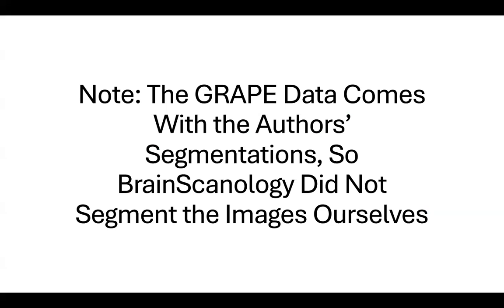An important point is that for this dataset, we did not segment the cup and disc outlines because the dataset was already segmented by its authors. We have shown with 4 independent datasets that whether we outline the cup and disc manually or use the outlines provided by the authors, our approach is still effective.